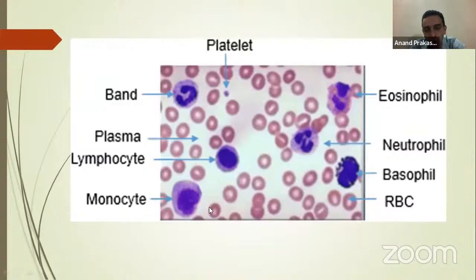And the mononuclear cells are the lymphocytes and the monocytes, because they're supposed to have one nucleus, like most other cells. A large cell with a lot of cytoplasm will be a monocyte. If you get a lot of monocytosis, you're thinking of infections. It could be viral, it could be tuberculosis, right? And sometimes rare diseases like juvenile myelomonocytic leukemia, not important, rare. But when you have a lot of monocytosis, that is what to think of.